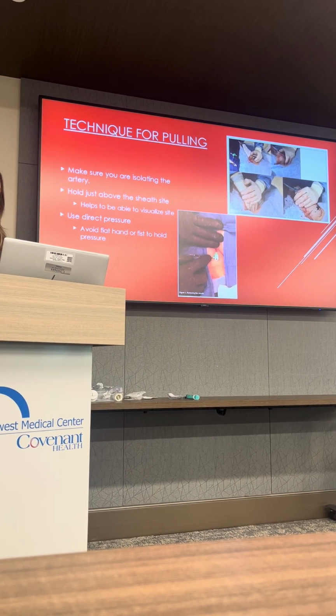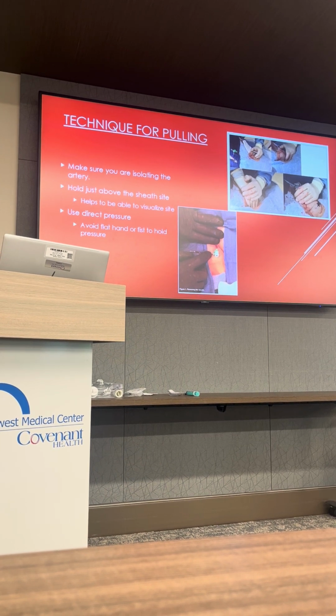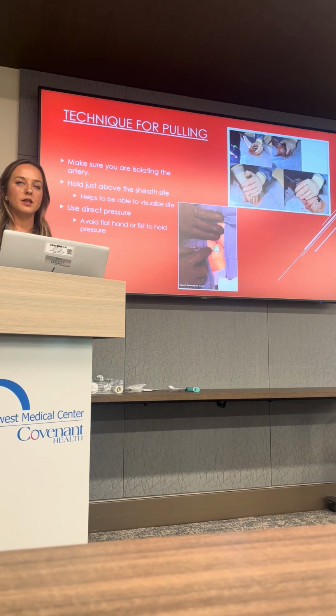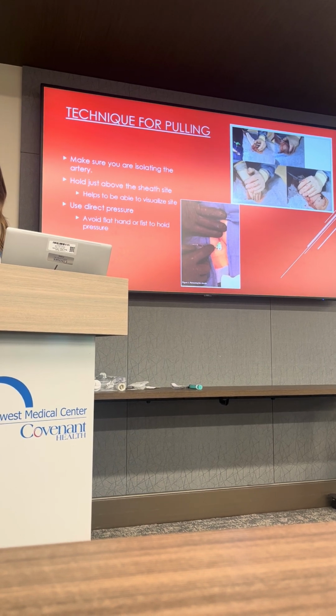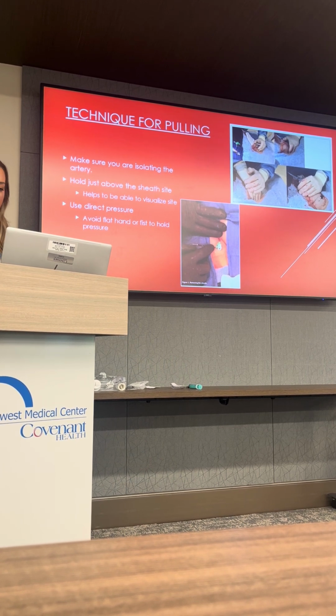And again, if you're uncomfortable with sheath pulls, if you've had bad experiences in the past and you want extra help, if you need extra hands on board, there's nothing wrong with that. There are additional resources in the ICU always. So it's better to be comfortable in a situation and know that it's being performed well, rather than being in an uncomfortable situation and getting into a stickier situation following.